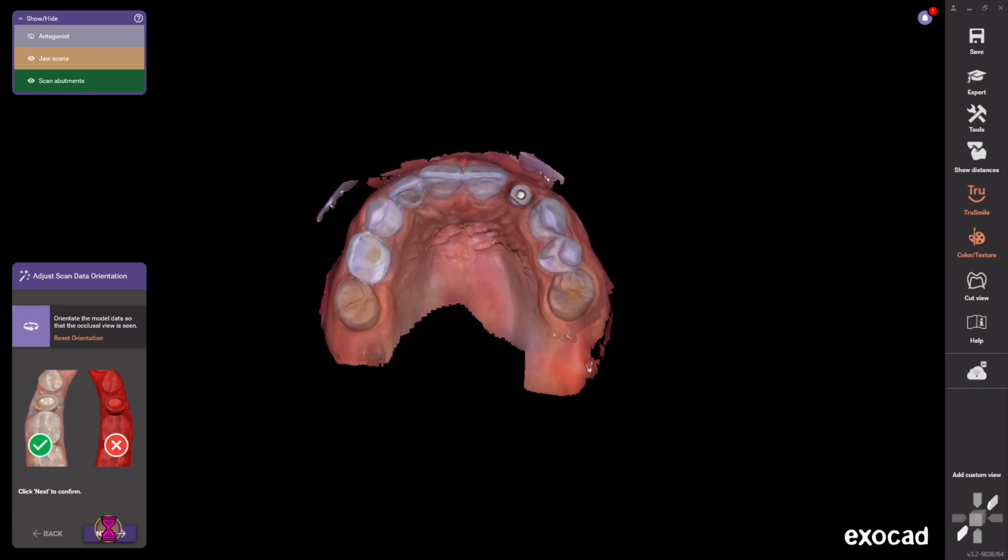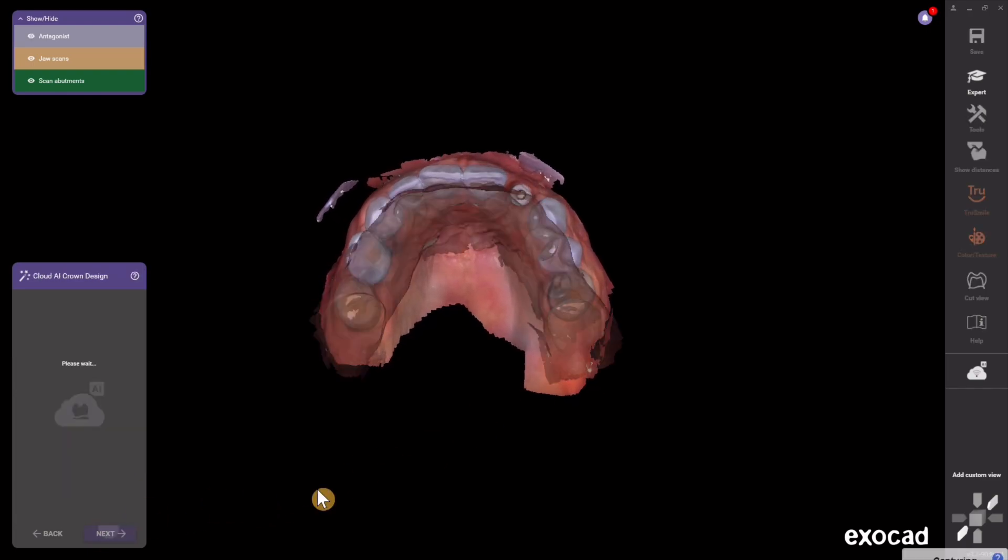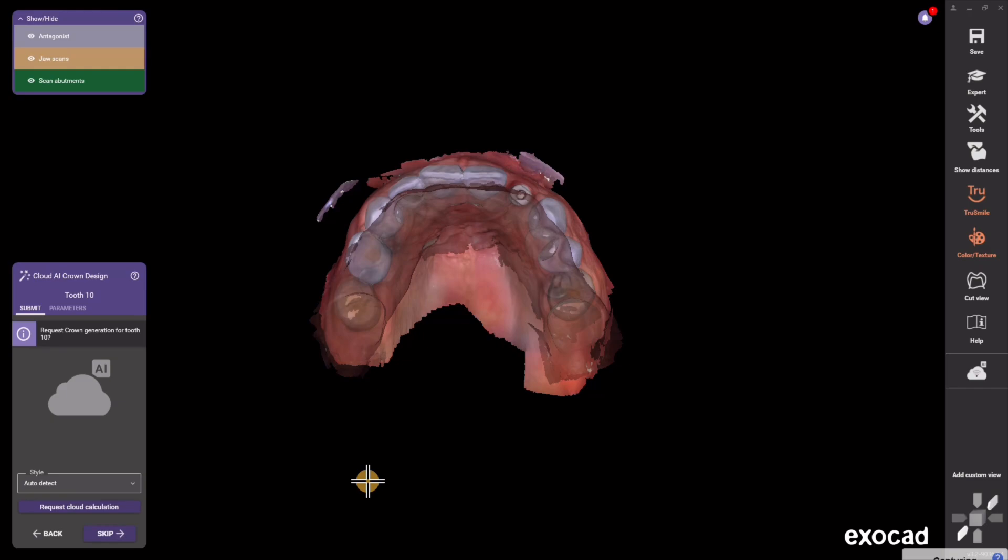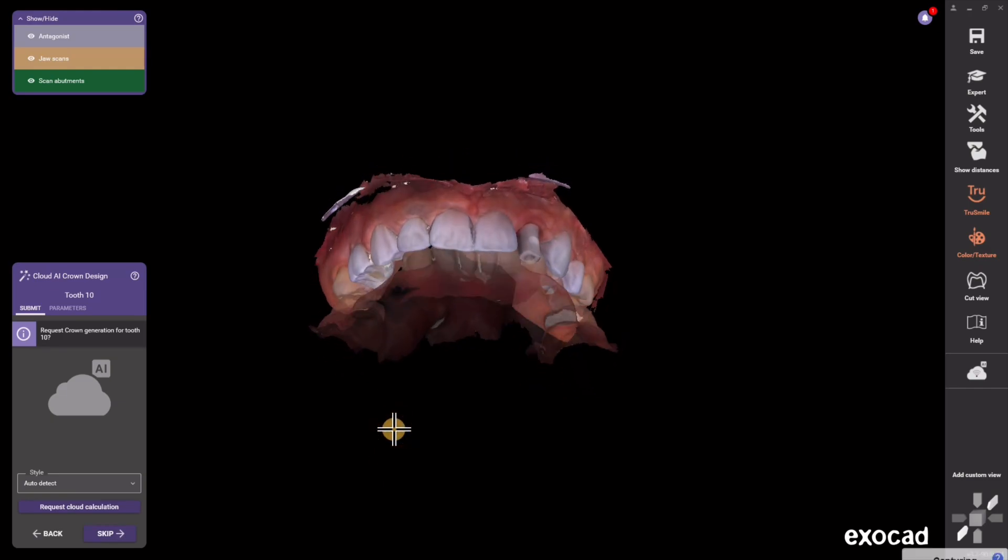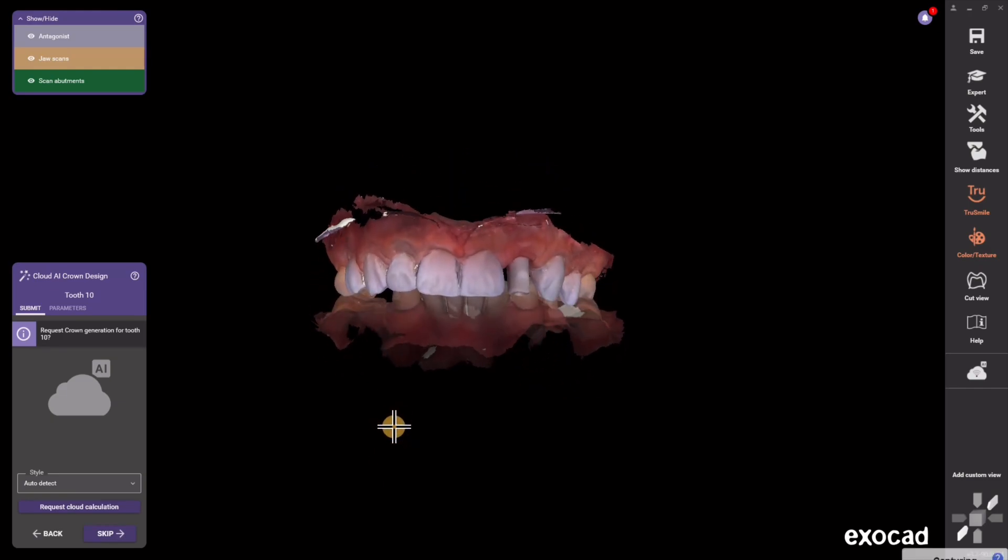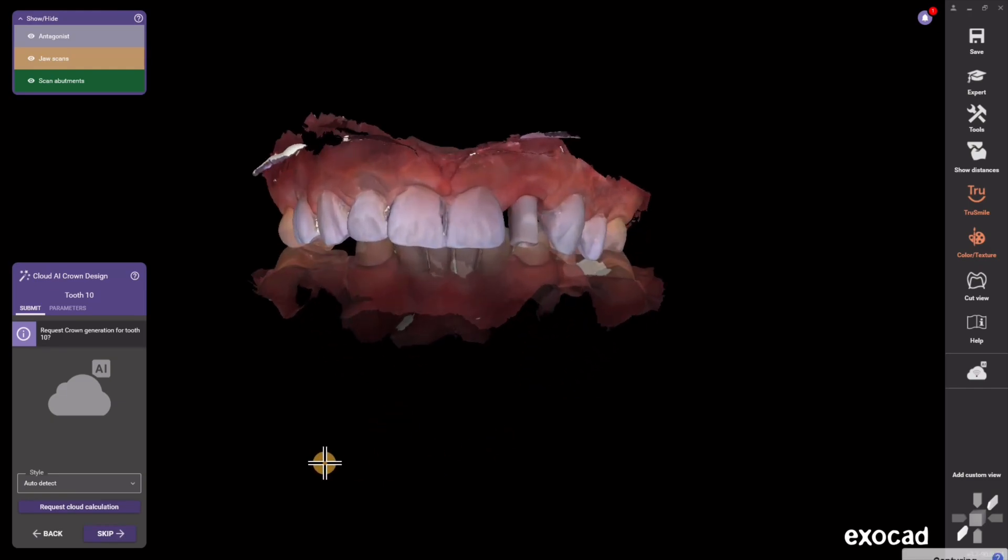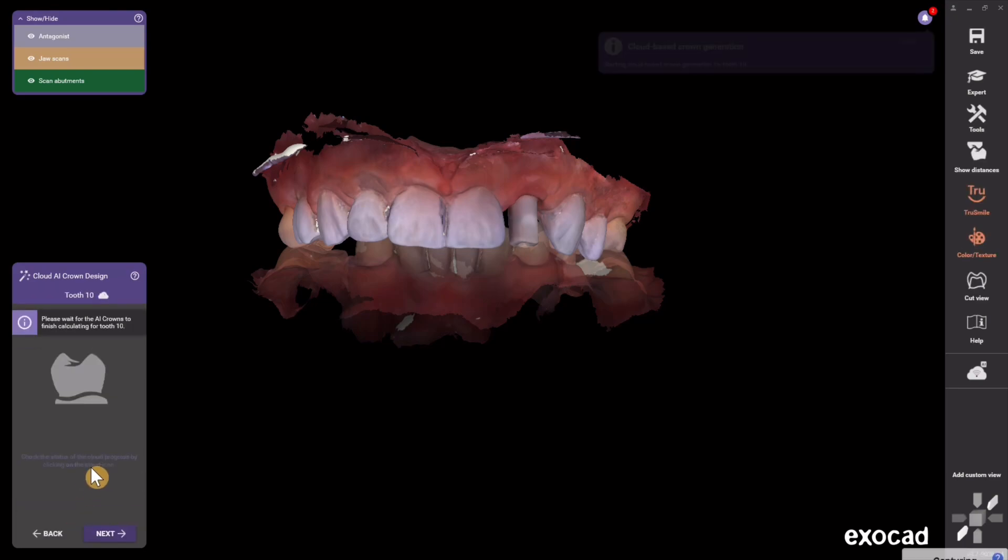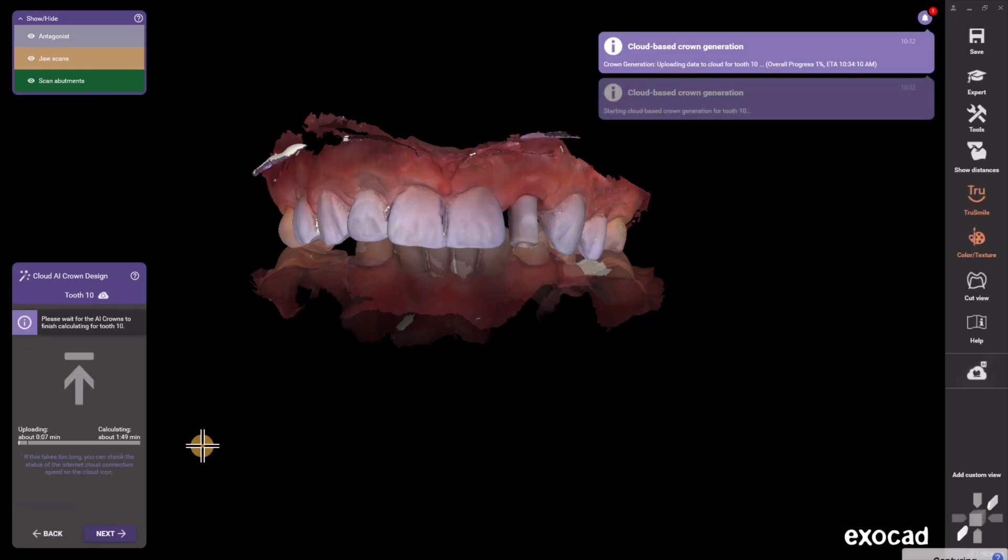Any STL, Ply or OBJ, pick your orientation from this straight down occlusal view, and then you'll get to the second tab which is this AI button and you're going to hit Start AI Calculation.